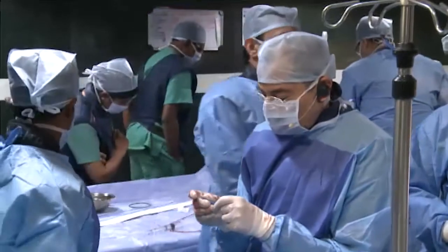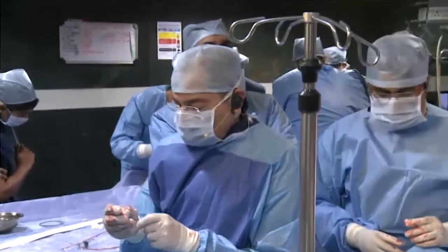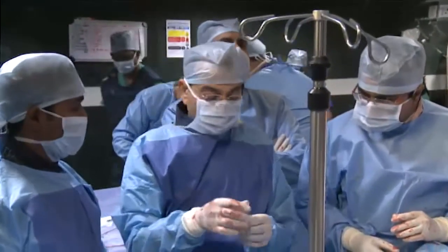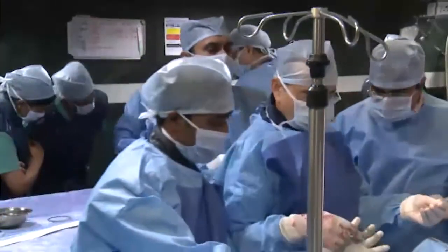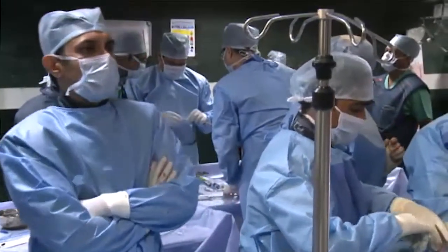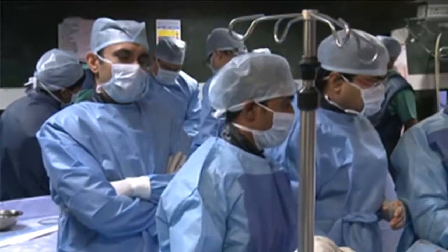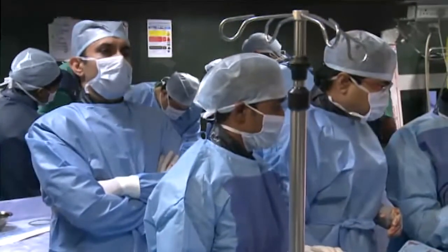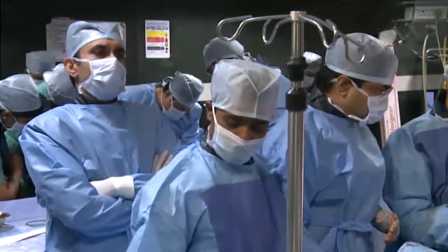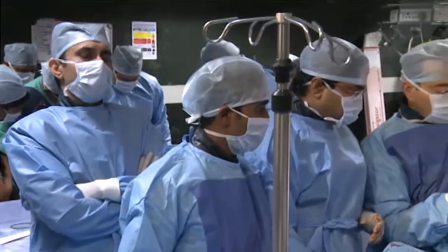Yeah. So, initially we were planning not to pre-dilate the valve, but the concern here is, as of now, this valve will be going through a 22 French sheath. And the femoral artery on the left side is 7.2. The external iliac artery minimal diameter is around 7.4. So if you look at the 22 French sheath, its OD is almost 24 French. And we will be stretching this 7.4 millimeter vessel up to 8 millimeter.